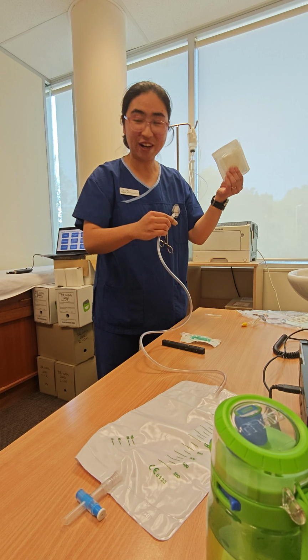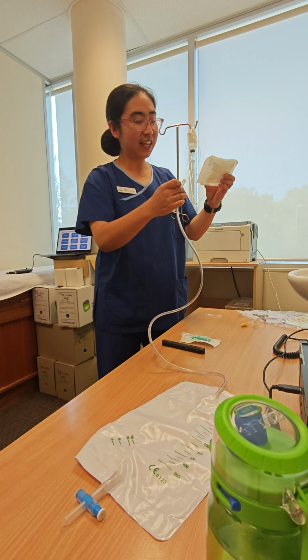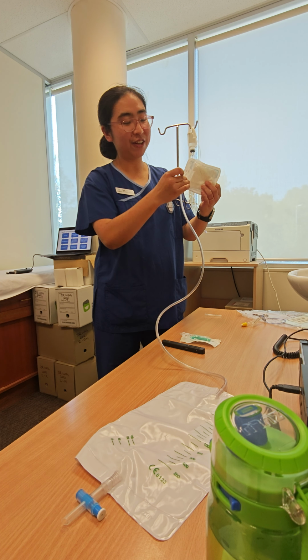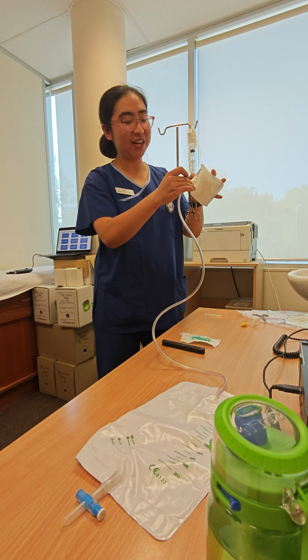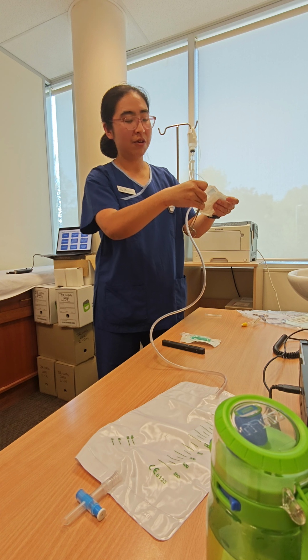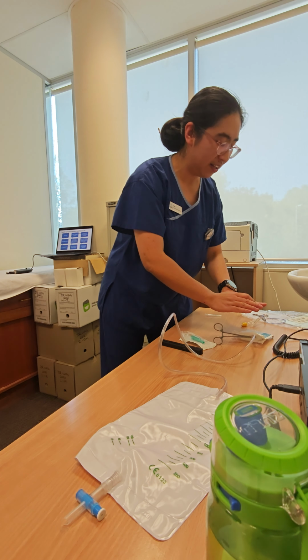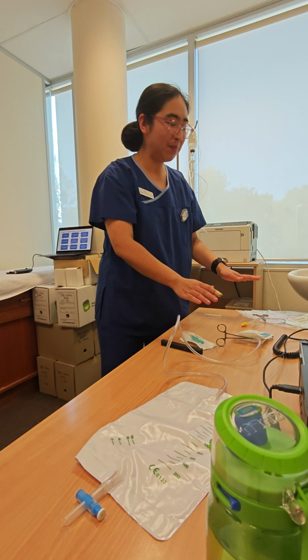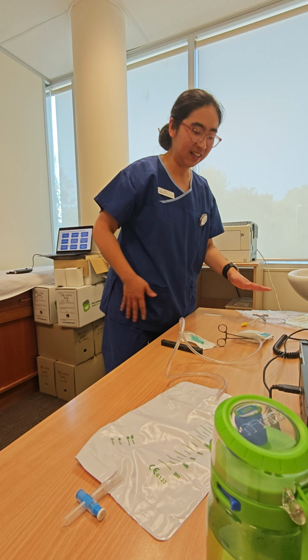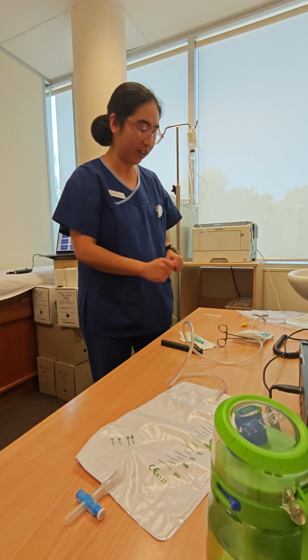And then we'll open the gauze, make sure it's clean, nice and tidy. Just gradually open that. Make sure the sterile part is in the middle of the gauze. Wonderful. And leave it on the patient's body, on the mid femur of the patient in this area. We just leave it on top of that. Make sure he is not moving.